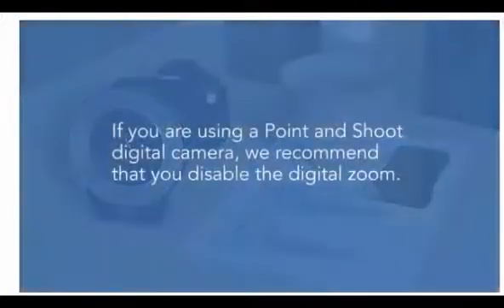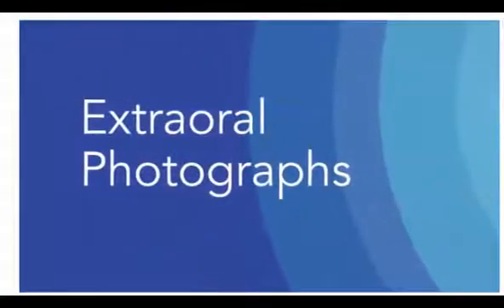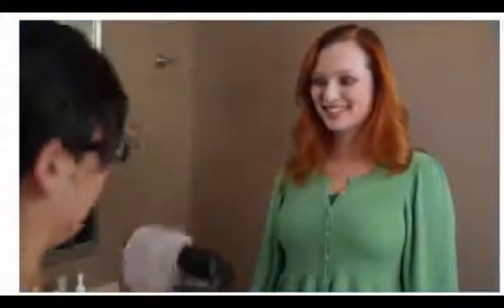Please note: if you are using a point-and-shoot digital camera, we recommend that you disable the digital zoom. Please refer to your camera's user manual for further instructions. Begin with the extra-oral images. Include frontal repose, frontal smiling, and right profile photos, reminding the patient to keep their bite closed during this process.